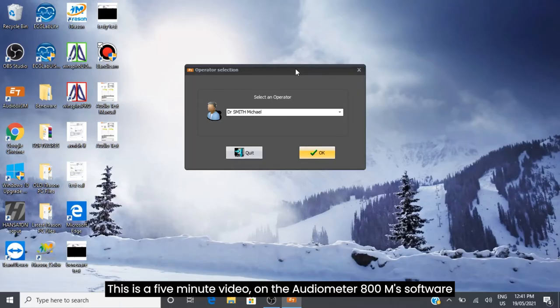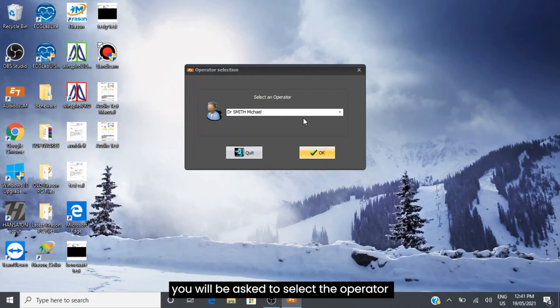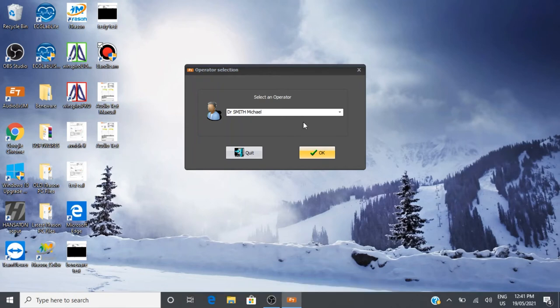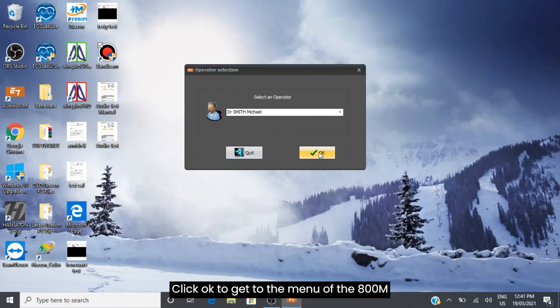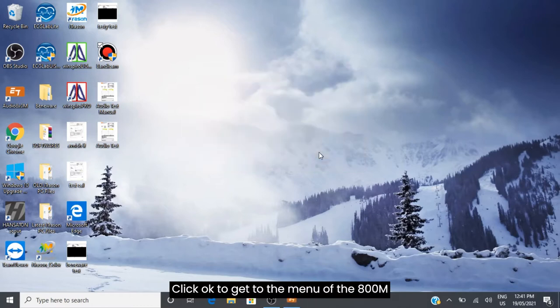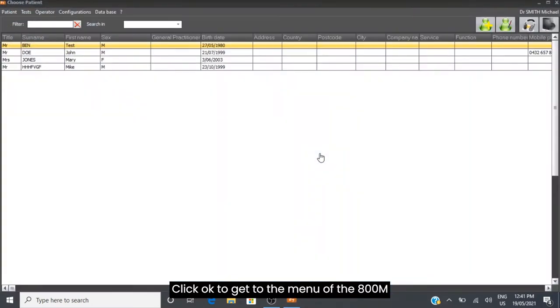This is a five minute video on the Audiometer 800M software. You will be asked to select the operator - you can create more operators once in the menu. Click OK to get to the menu of the 800M.